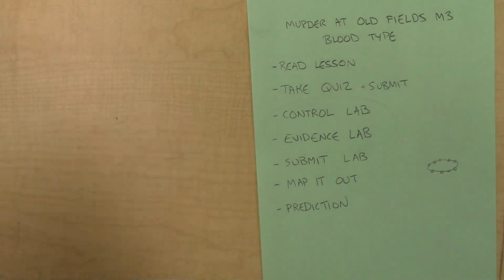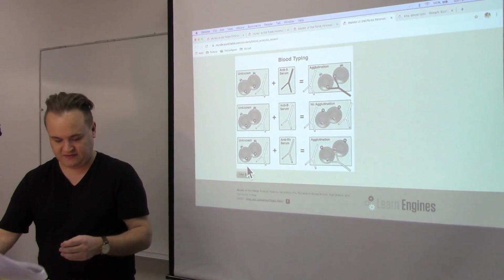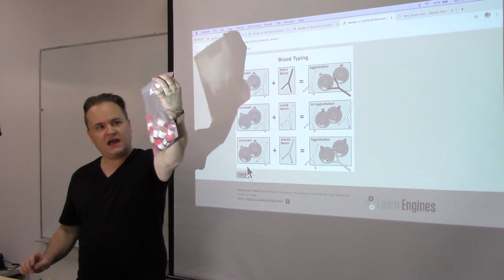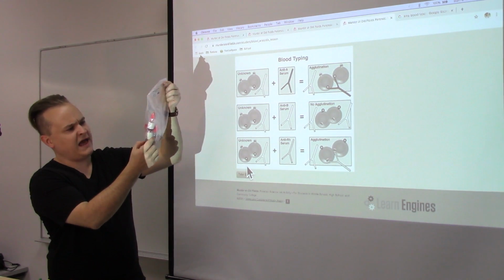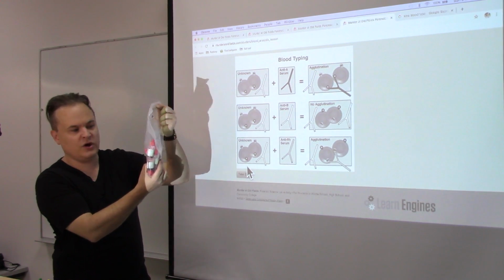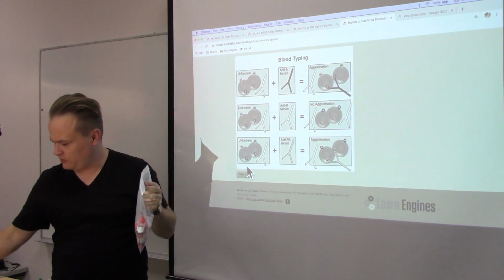What you will get, here we go. So we actually have a bag of blood. And every one is labeled, like suspect 3, or evidence H from the front room, or suspect 2, or evidence G from the window. It tells you where every blood is from, just like it would if you look here.